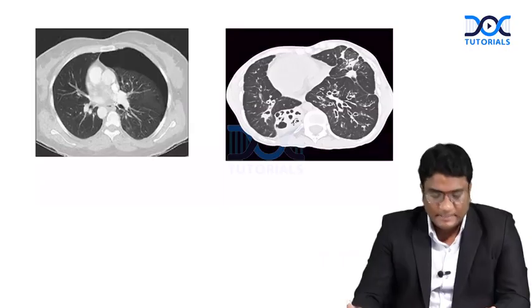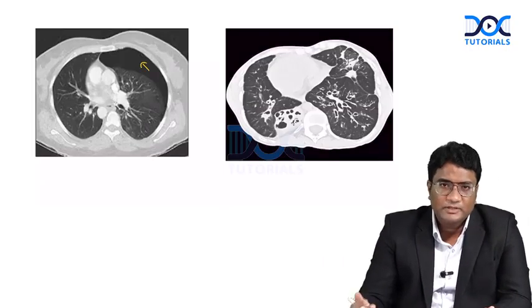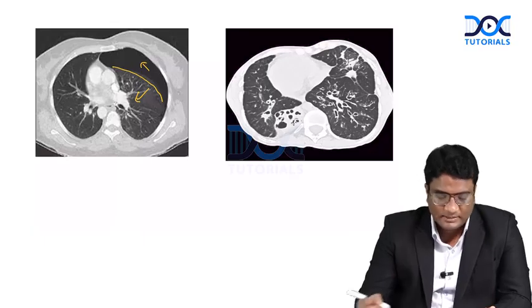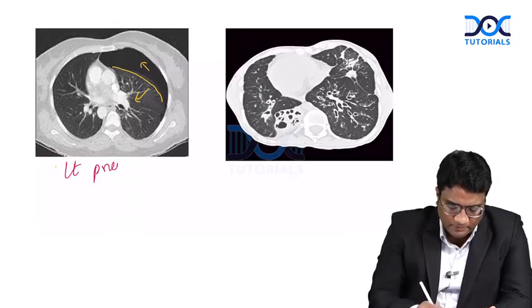And look at this CT scan. In a case of trauma, in the left side, you can see this hypodense area, which is not having any bronchovascular marking and which is also causing the visceral pleura to be separated and the lung to be collapsed towards the hilum. So this is suggestive of pneumothorax. So this is how left pneumothorax would appear.